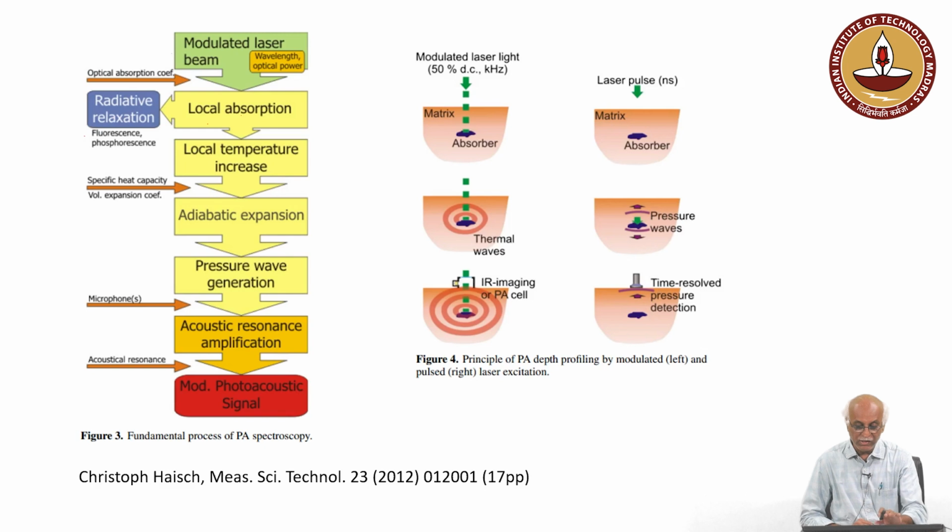So, this is the basic idea. What it captures is, let us say, beneath the skin or within the body, any particular position, let us say it is a thyroid gland, etc., located not directly exposed, is it not, but the laser beam can propagate through the skin tissues and can interact with this thyroid gland, okay.